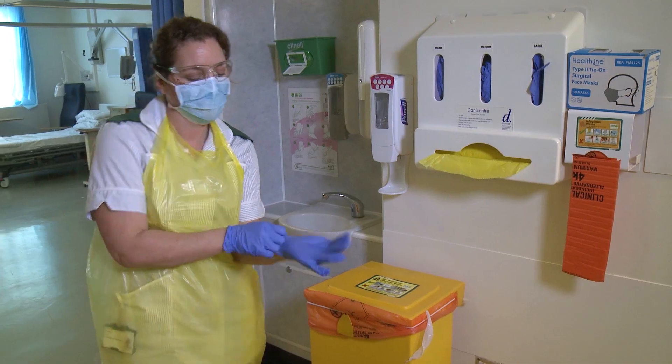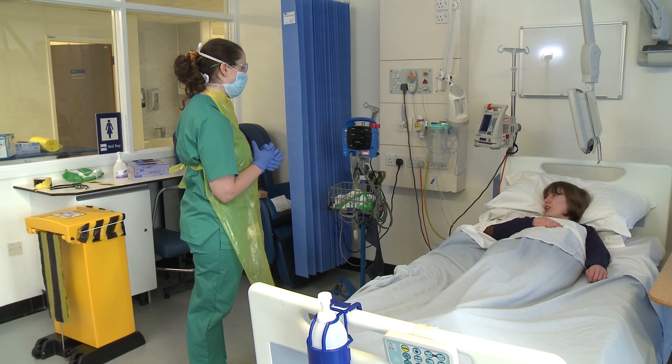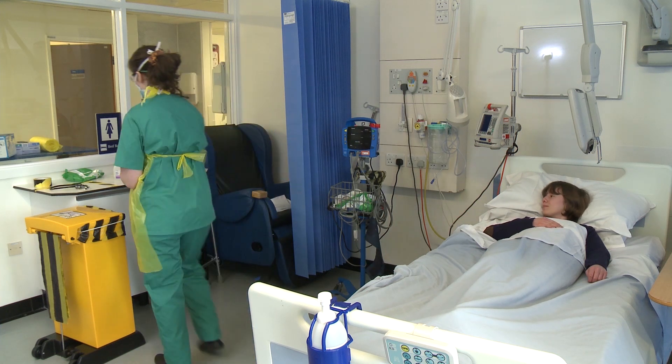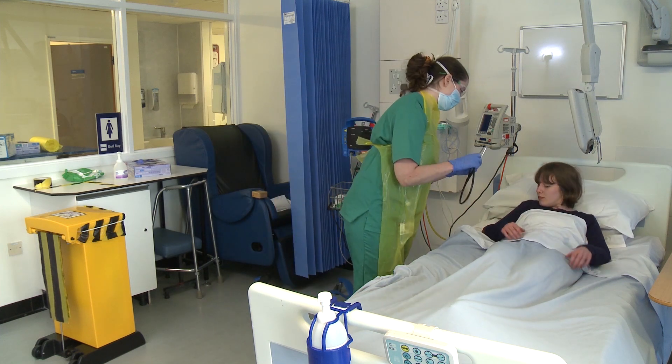Put on gloves. Please ensure a safe distance is kept from the patient's face at all times. Ensure you have any equipment you require to hand and that a regular cleaning schedule is in force.